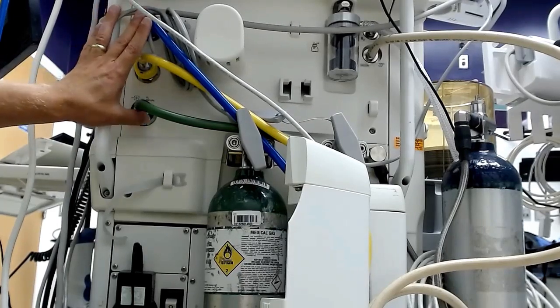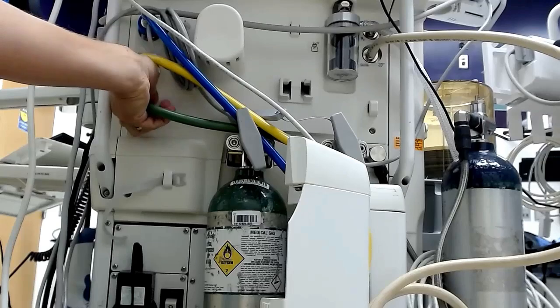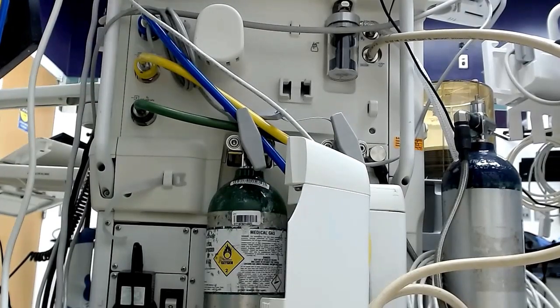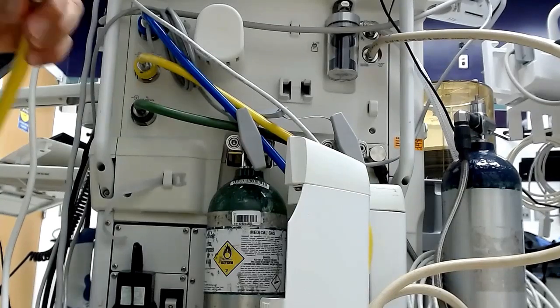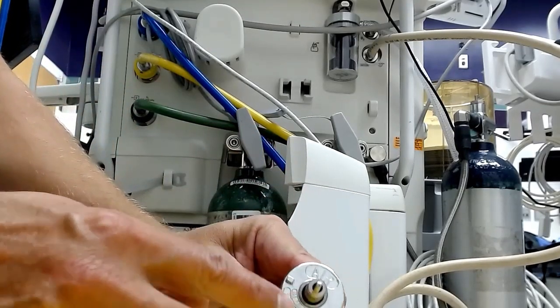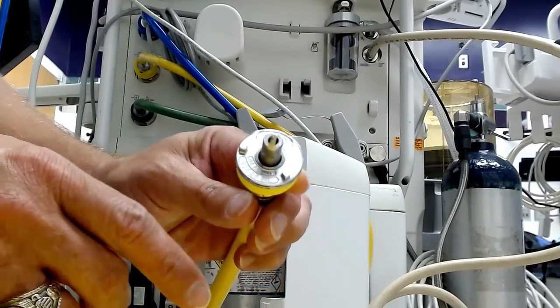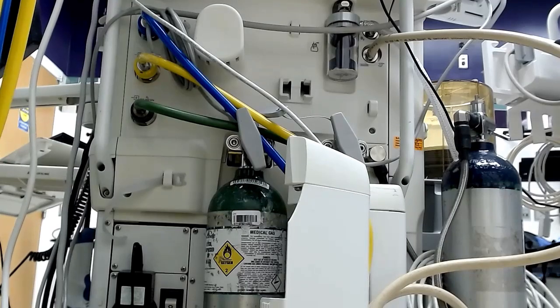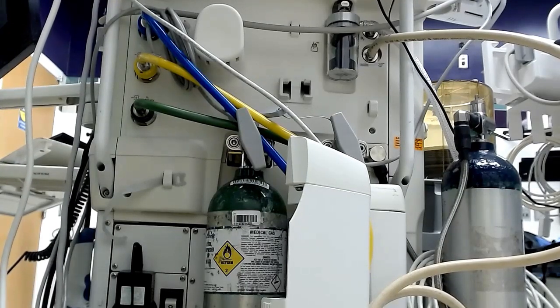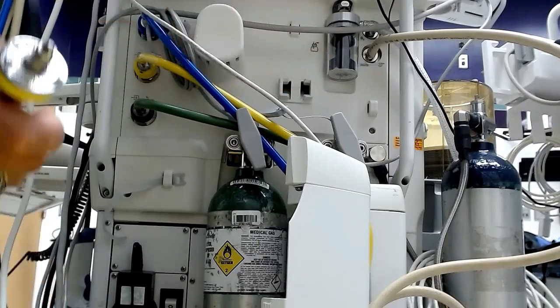Now, these have what's called diameter index safety systems. Through the diameter index safety system, what you're going to see is a mechanism where it has a specific configuration on it, where the notches or the pins are in a different manner for air and oxygen. And you can see that here through oxygen and air.